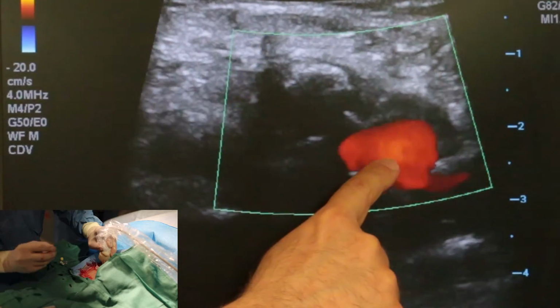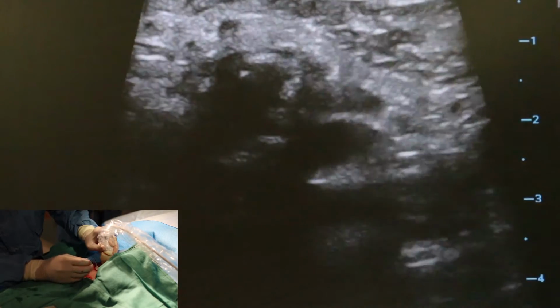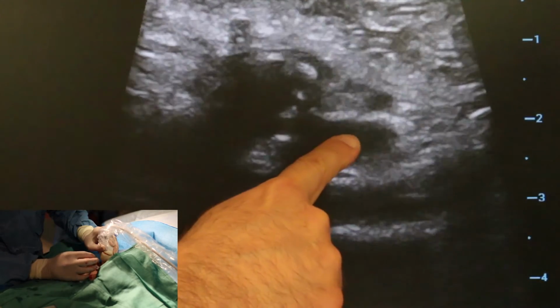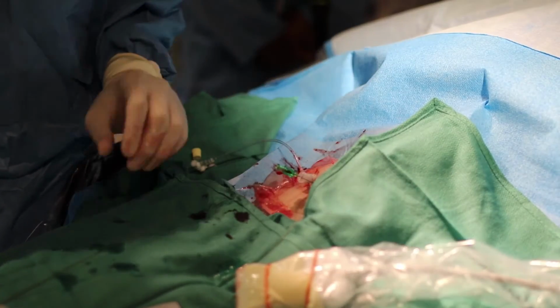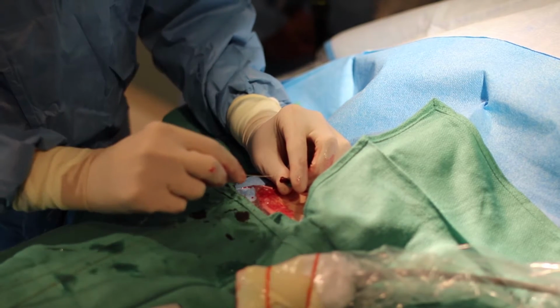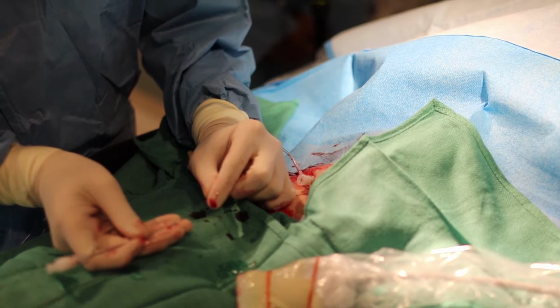It's often easier to penetrate the vessel with the color off, so we'll turn the color off. Again, I'm going to put the micropuncture right underneath the probe, and then you can see a little bit of an indent. And then enter. It's already coming back, you can see. I'll push the microcatheter wire, and we have access to the artery and the vein. It's very quick.